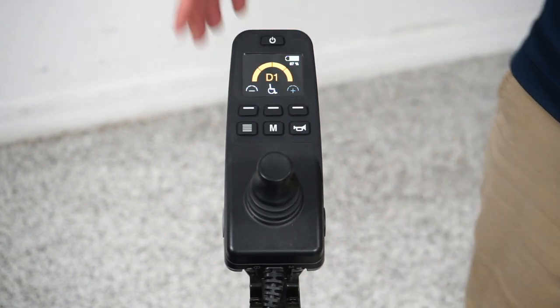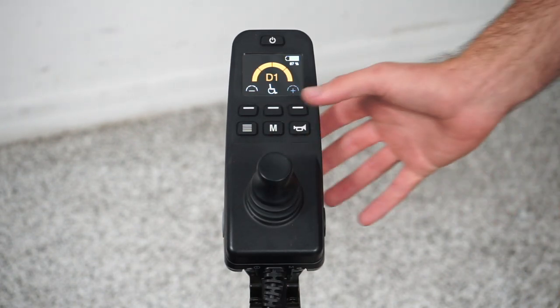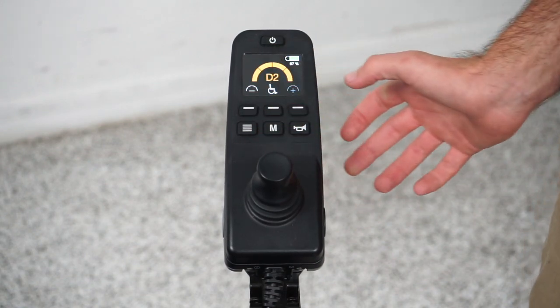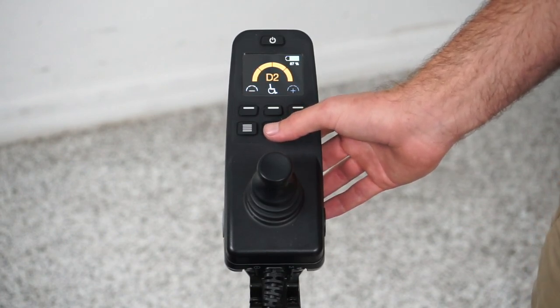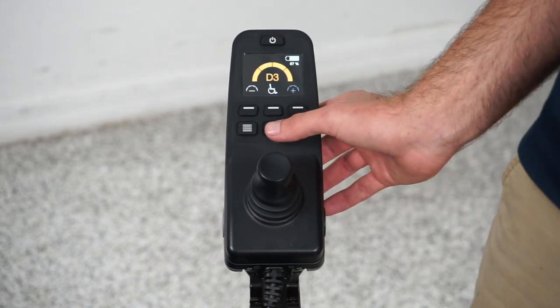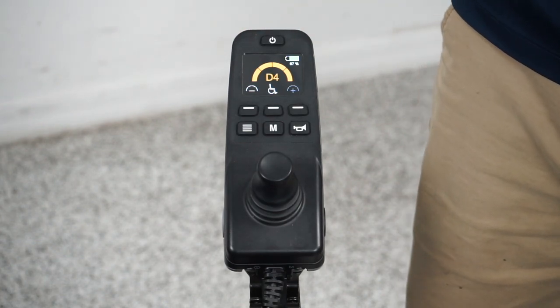I'm going to go over the mode button. This will change your different modes. We're in drive one right now. If I press mode, we're now in drive two — kind of an indoor moderate speed, top speed maybe two and a half to three miles an hour. Drive three is an outdoor moderate. And drive four will be your fastest speed — six miles an hour on your quantum power chair.